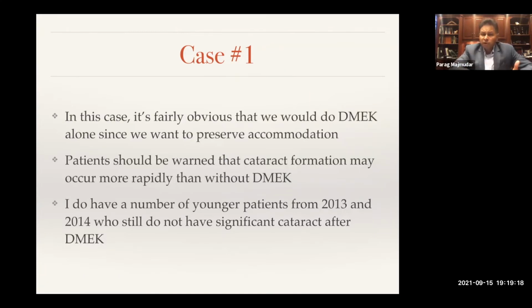We want to preserve accommodation. You have to warn the patient that cataract formation may occur more rapidly than if you didn't do the DMEK at all, I guess. And as I said, when I first started doing DMEK surgery in 2012 or 2013, I did this in a few cases where, at that time, the trend was that, you know what, you've got to do them both together.